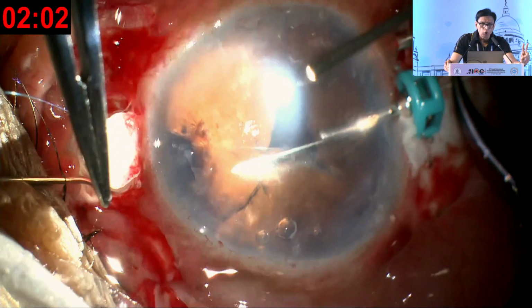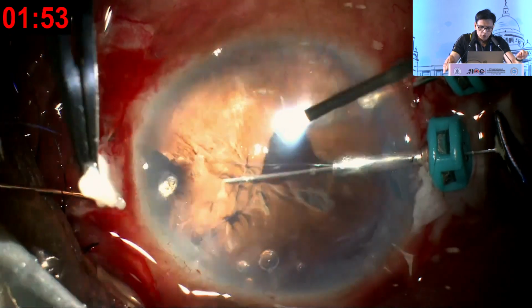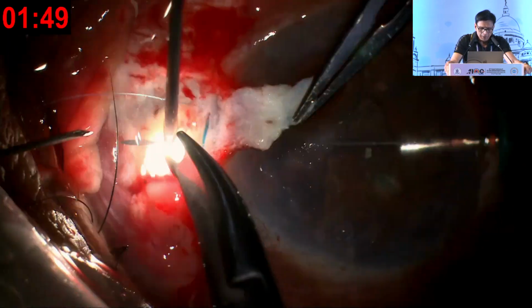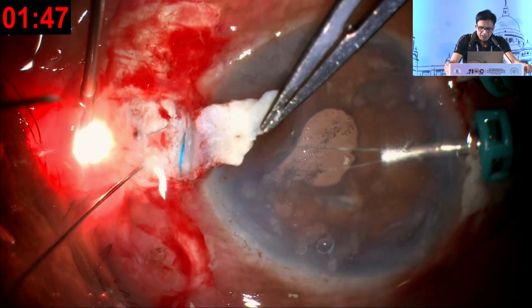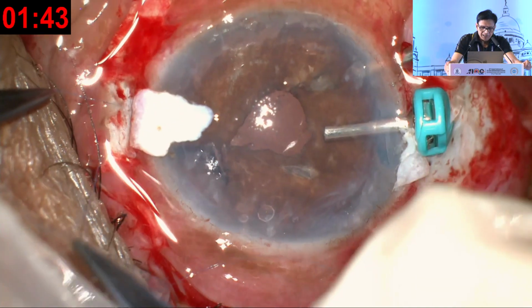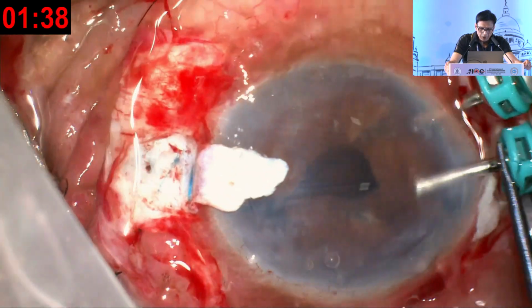Ladies and gentlemen, if you know two techniques, and I repeat it again, the 4-throw pupiloplasty and the trocar assisted iridodialysis, you will cover everything in iris repair. So here you see now the second arm of the double arm needle coming out. Once that's there, I'll just pull it and tie it, and you see that iridodialysis repaired.